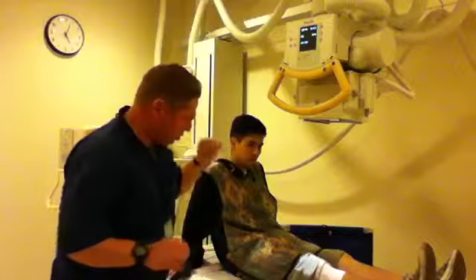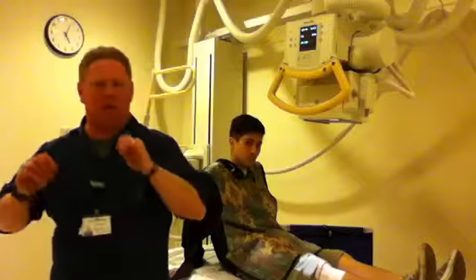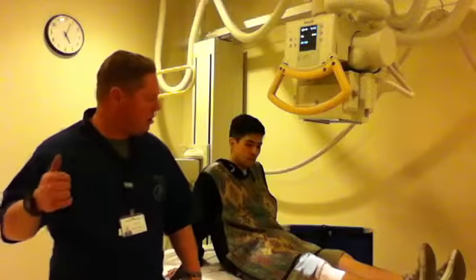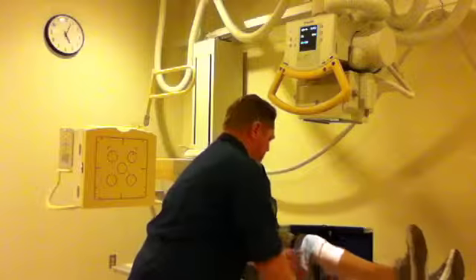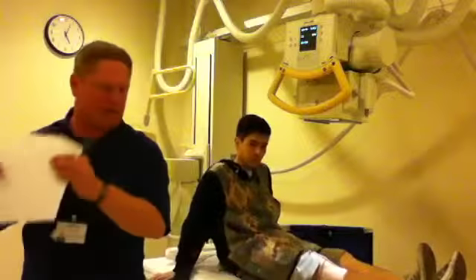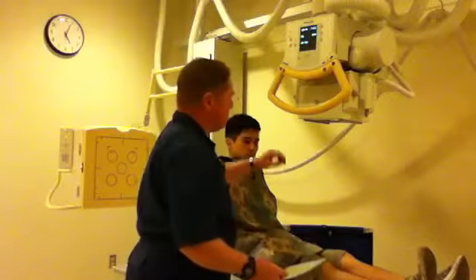Make sure he's covered. And then go ahead and go back, have him hold still. Shoot. Thank you. Take it back, stick it in the reader, making sure it's under the right name in the exam.